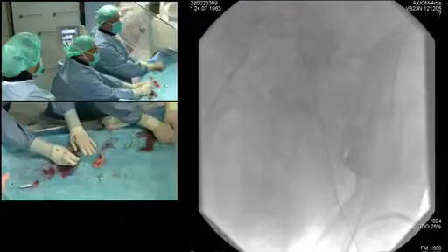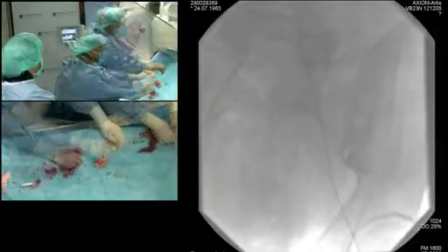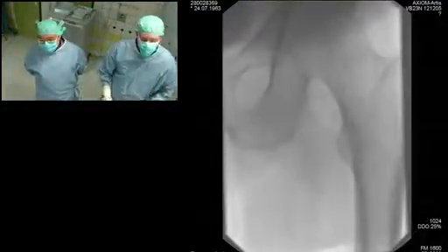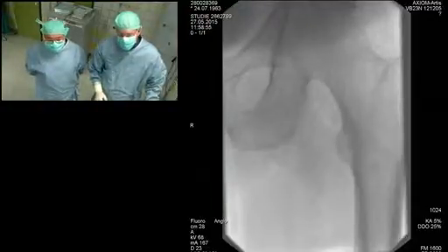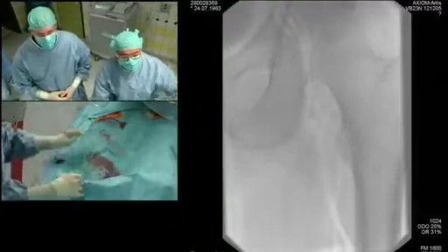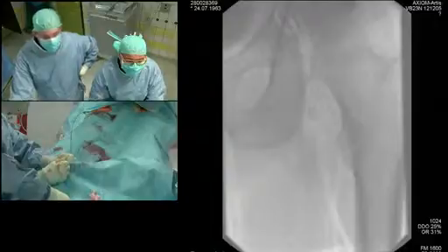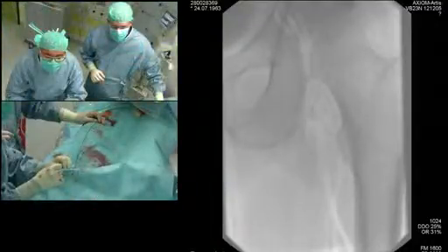Okay, now it's coming. The first step I think would be now to get into the bypass and to bring a wire down, and we will use a support catheter to navigate us downstream. On a good way, huh?